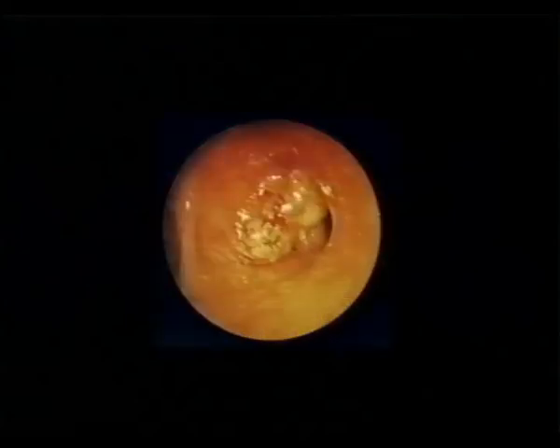Case of acute bronchitis, here you can see edema and the orifice is narrowed. There's a bleeding into that. This is a case of malignancy. This polypoidal growth turned out to be a squamous carcinoma. You can see the bronchial orifice is narrowed by about 80%.